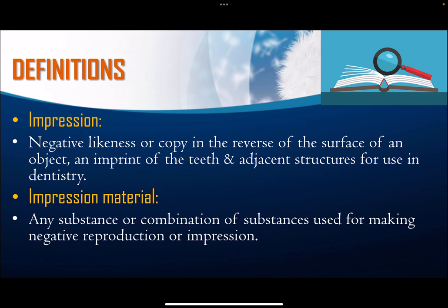Impression can be defined as a negative likeness or copy in the reverse of a surface of an object, an imprint of the teeth and adjacent structures for use in dentistry. Impression material is any substance or combination of substances used for making a negative reproduction or impression.